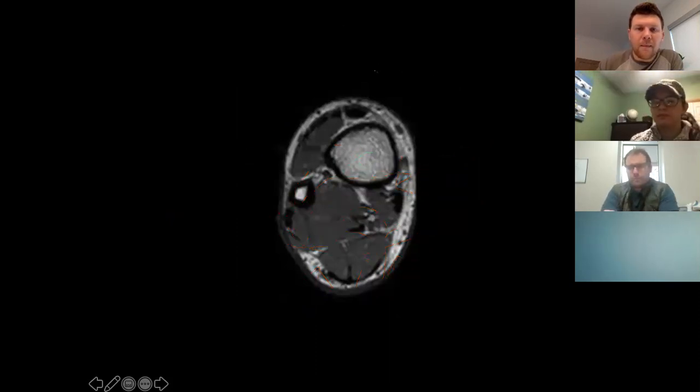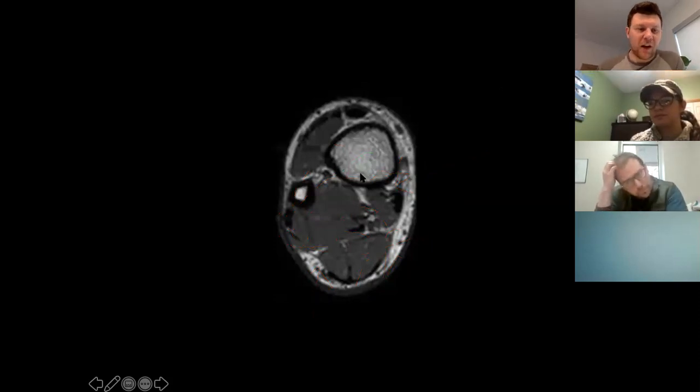Okay. Anybody want to do this one? Now we're getting more into what we're going to look at on a regular basis. Yeah, I'll give it a try. Okay.